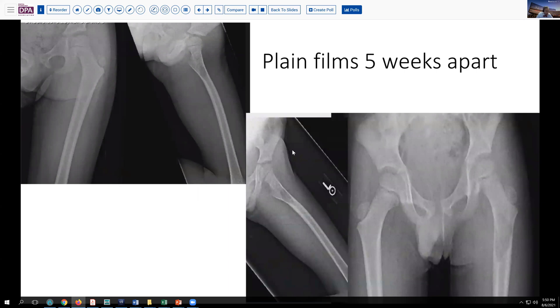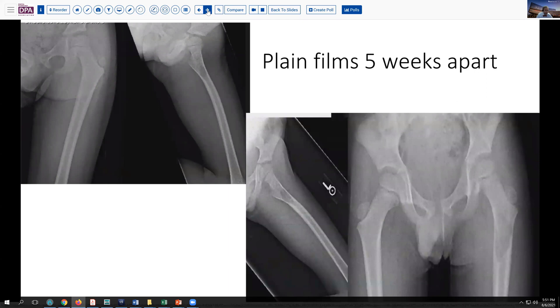Things progressed and it was several weeks later before he came back. A repeat plain film at that time shows a really quite progressive lesion with clear cortical thickening, maybe some elevation of the periosteum, rims and indentations on the inner table of the cortex, and maybe some early penetration into the surrounding tissues. So this is clearly an infiltrative and fairly rapidly progressing process.